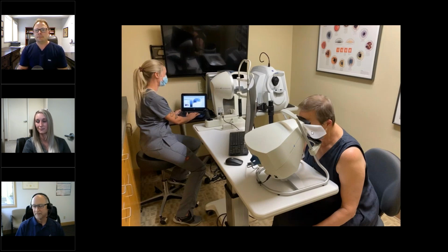Yeah, that is fantastic. We do use the FDT as one tool in our arsenal to find potential problems. Yeah, for sure. Another question here. I think you talked about ptosis testing. Can you compare the ptosis testing in the Smartfield versus what it was previously in the Humphrey system?